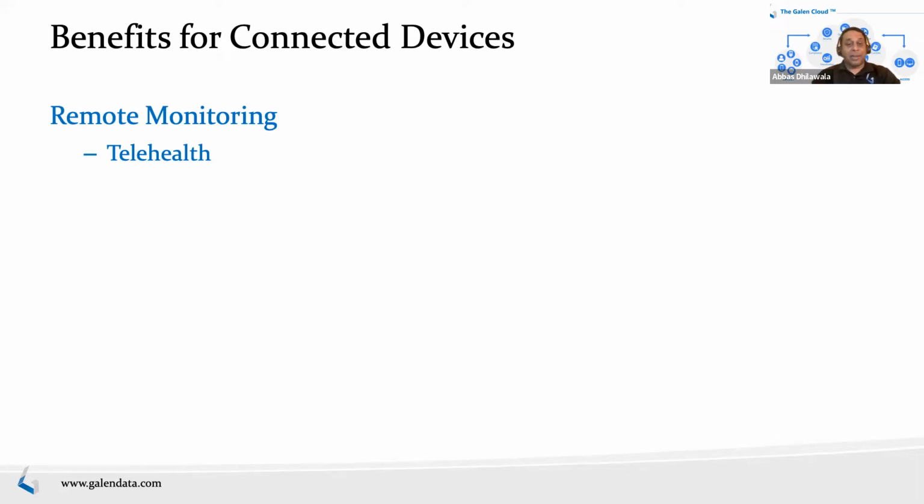And so telehealth requires devices to be connected so they can be accessed remotely by the providers and other stakeholders that need access to that data. And then patient compliance. There have been some industries where patient compliance is required as part of reimbursement. For example, sleep.